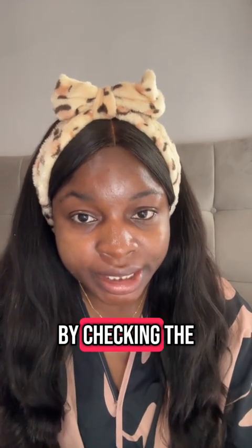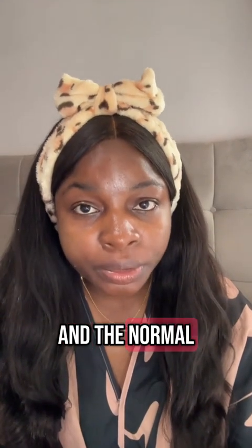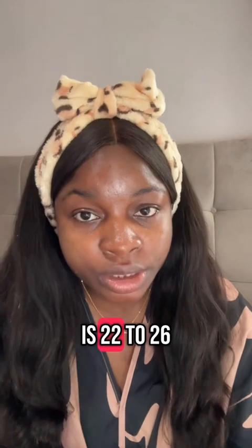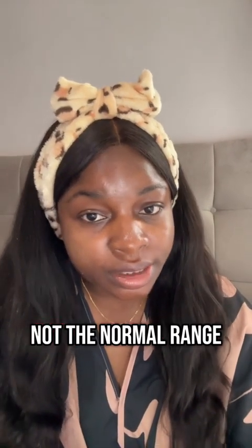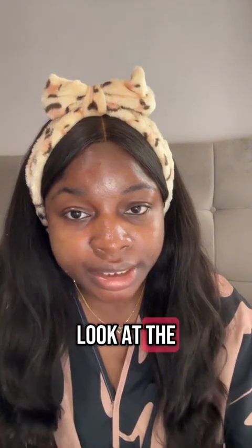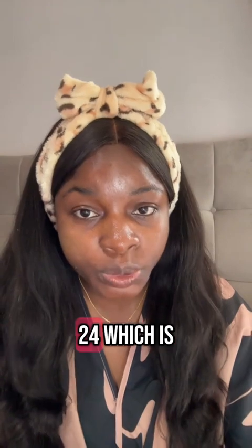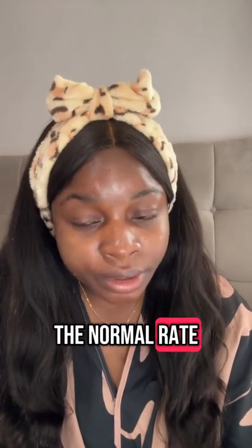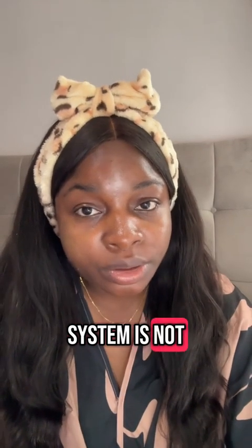How do you check that? By checking the value of the bicarbonate. The normal range, from what I showed earlier, is 22 to 26. Anything outside this range is not normal. Let's assume the bicarbonate is 24, which is in the normal range. That means the renal system is not doing anything to compensate.